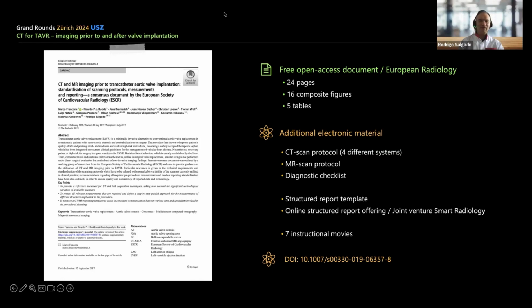So if you use, for example, the standard cardiac CT protocol, where we preference the phase in which we think that we will have best image quality, then you will not get the best results, because you want to have, of course, a functional evaluation, and you want to have consistent image quality. It, of course, comes at the price of a higher radiation dose. But remember, in this population, radiation dose is not our main issue, it's diagnosis. If a 90-year-old gets something from the CT scanner after 15 years of life, so he will be 105 years old, and I will personally apologize. But I would go for diagnosis over lower radiation.